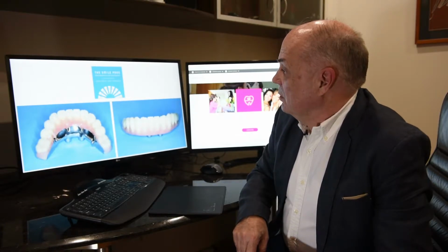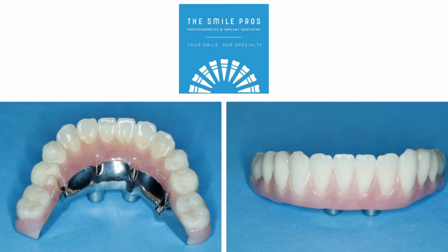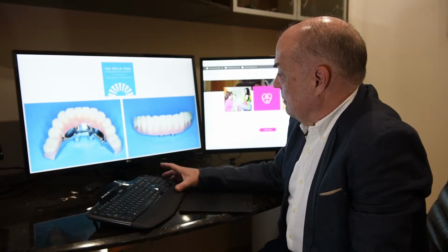Now today I want to talk about particularly the all-on-4 technique and some other options to help solve problems with dentures. These are heavily marketed and poorly explained. Just going to have a little chat about what the all-on-4 is. It's a technique that's been heavily promoted around the world, and a lot of the general public have become aware of it through radio and television advertising. And it has some advantages and some disadvantages.